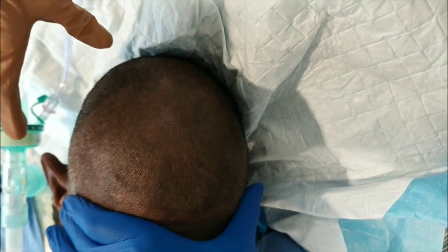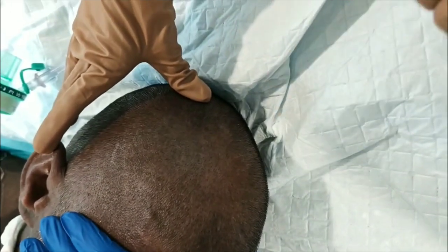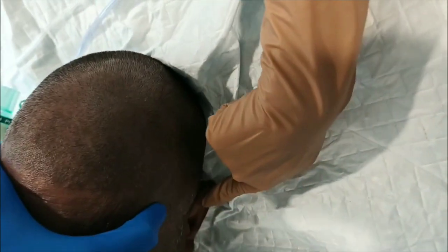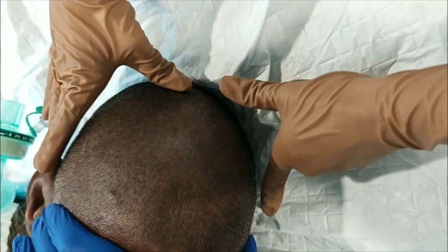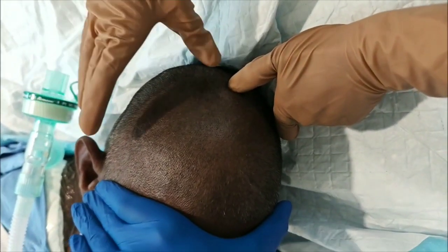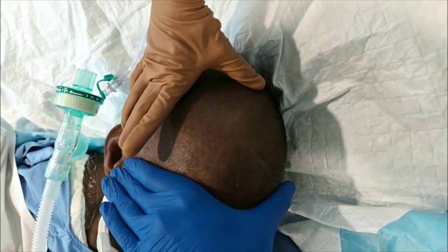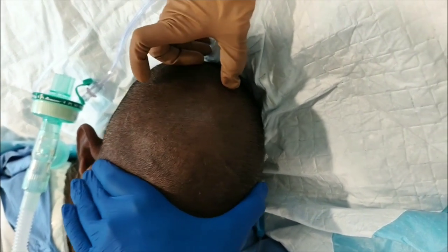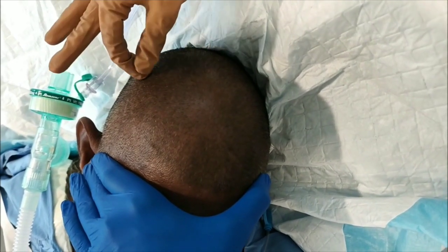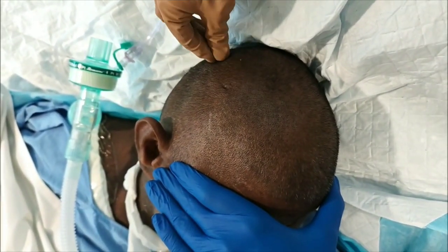For recording placement based on the 10-20 EEG international system, we take the distance from nasion to inion, as well as from the left pre-auricular point to the right pre-auricular point. The midpoint of those measurements is considered CZ. Ideally this is done using a measuring tape, but with experience it can be approximated. The approximated CZ is here, and C3-prime comes midway — with SSEP recording placed two centimeters posteriorly to C3.